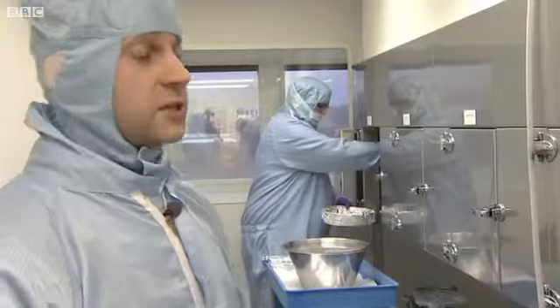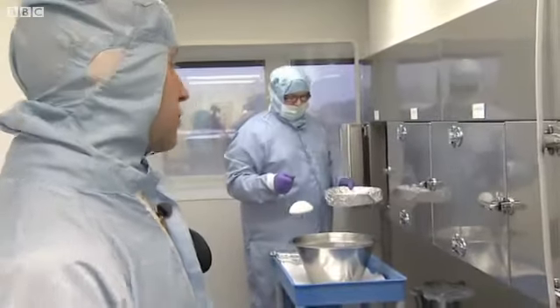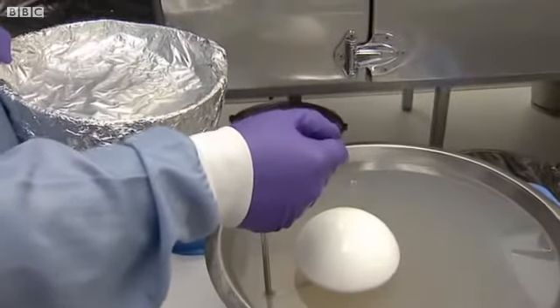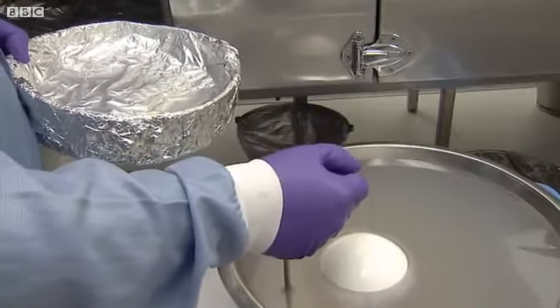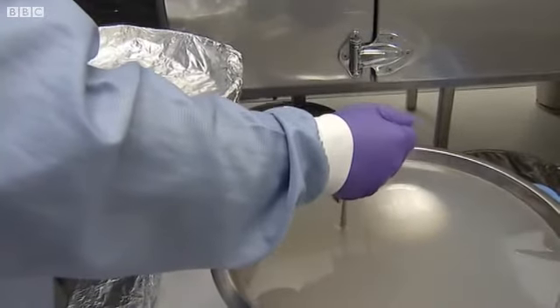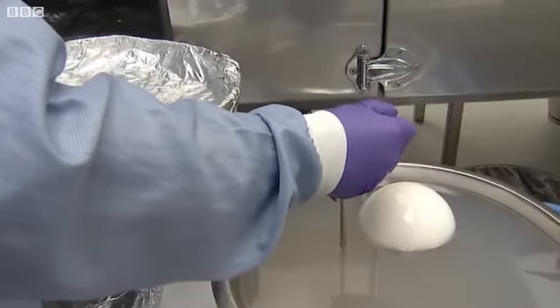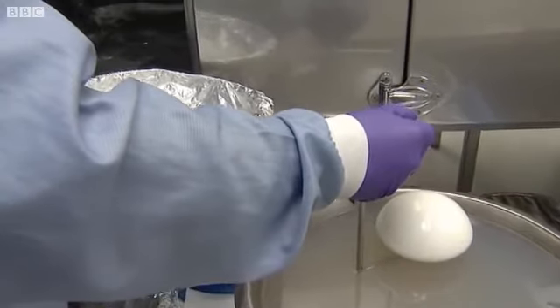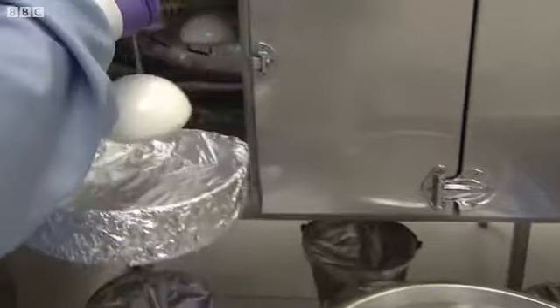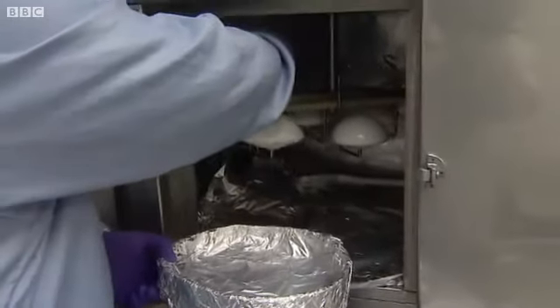Okay. And this stage here, this is the first step of the manufacturing process. This is the shell manufacturing process, whereby we would dip a shell on a plastic mould, and we'd dip the shell into long-term implantable grade silicon elastomer, which is sourced from an approved supplier, whereby we build the number of layers up to create the required thickness design specification, which is crucial to the integrity of the shell.